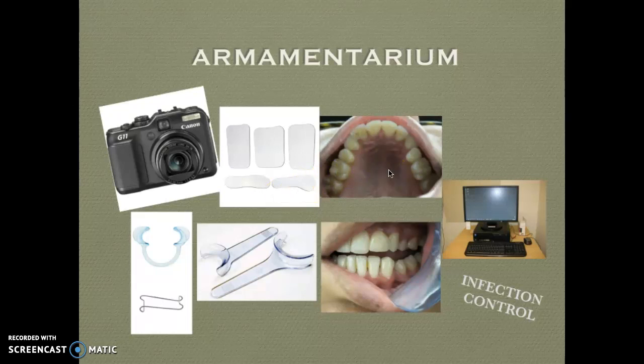This is the maxillary arch from an occlusal perspective. So you're placing the mirror and then taking a picture in the mirror for this particular view. It would be a little difficult to recline the patient so far and get our head in there with the camera in order to get this view. So the mirrors using indirect vision are very helpful.